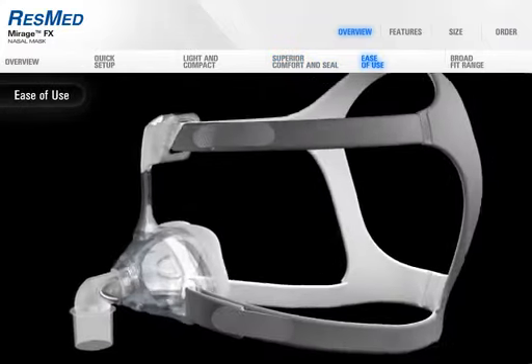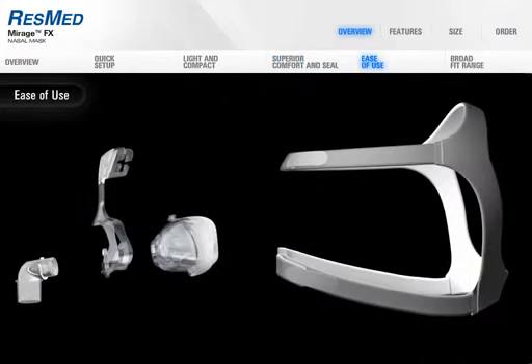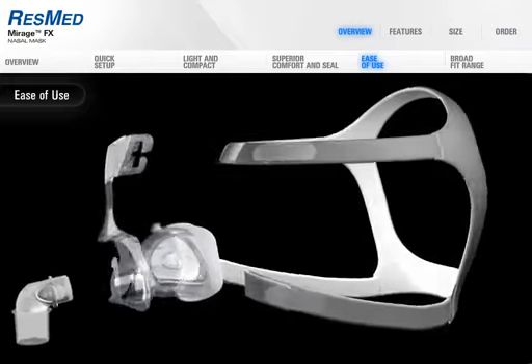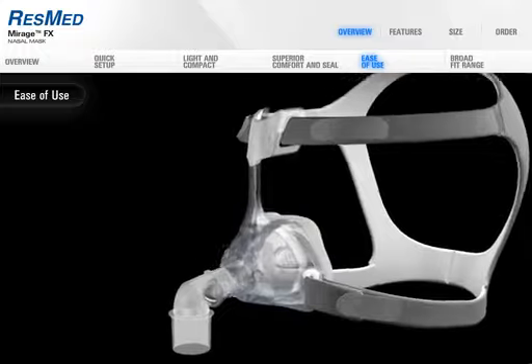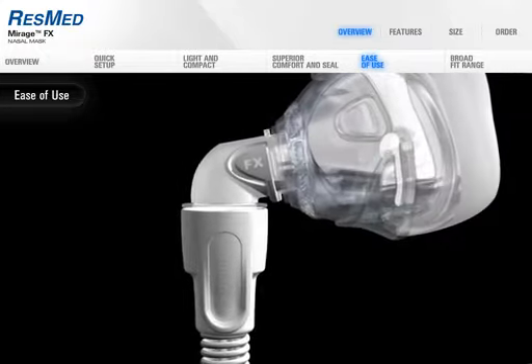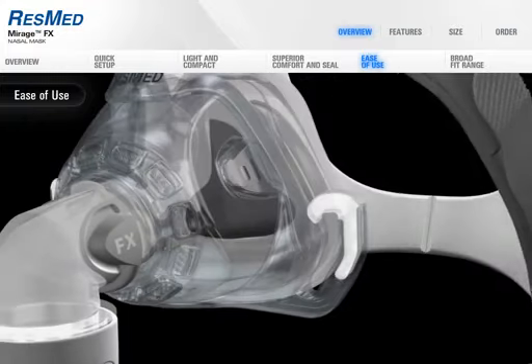Breakthrough features such as the squeeze tab elbow and overmolded headgear loops mean that patients will find Mirage FX effortless to assemble, fit, use, and maintain. And that makes compliance management easier for clinicians too.